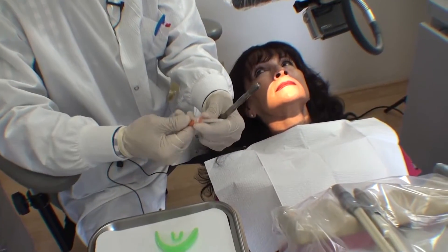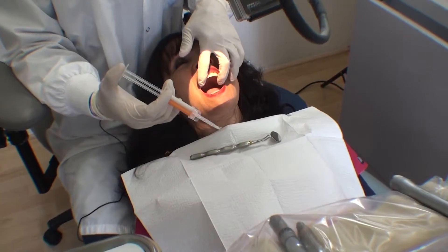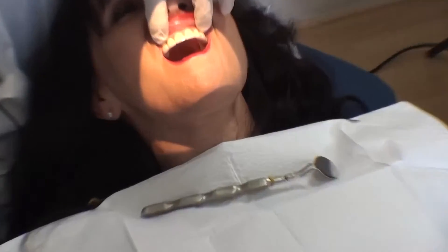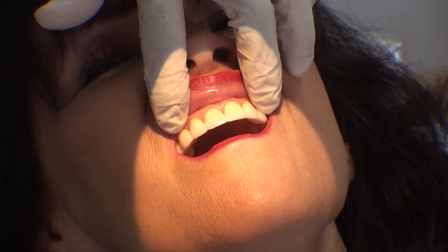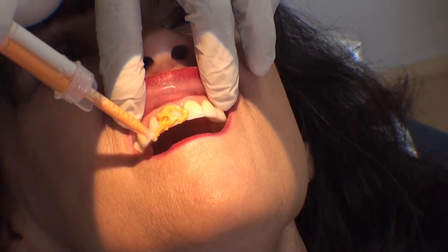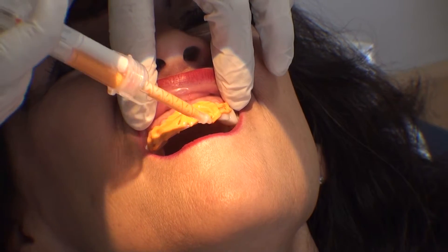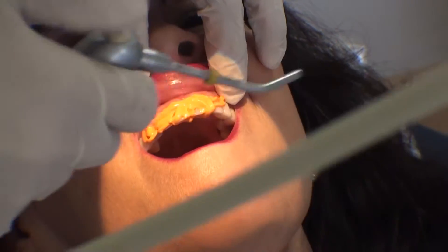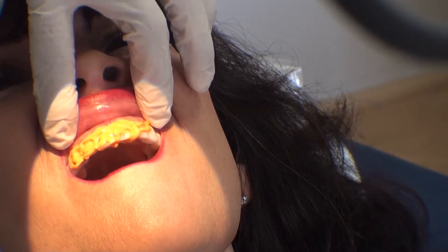After activating the syringe, you go to the mouth. Pretend that the teeth are prepared. First, you squirt around the prepared teeth that you're working on, then blow into the surface.